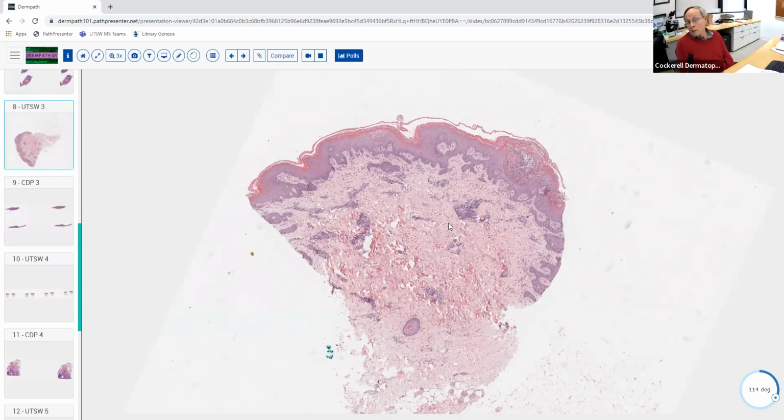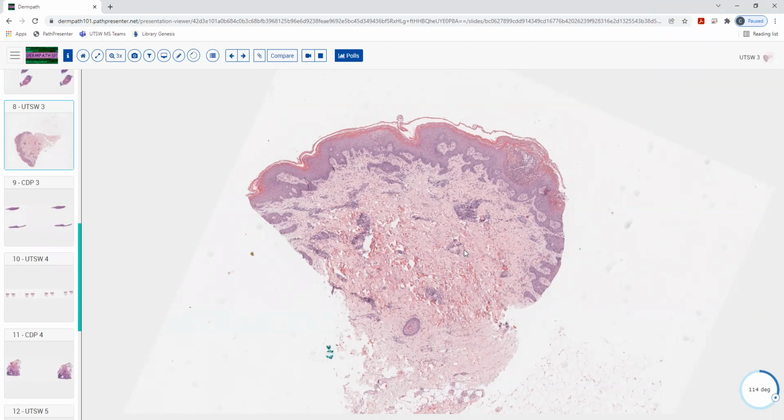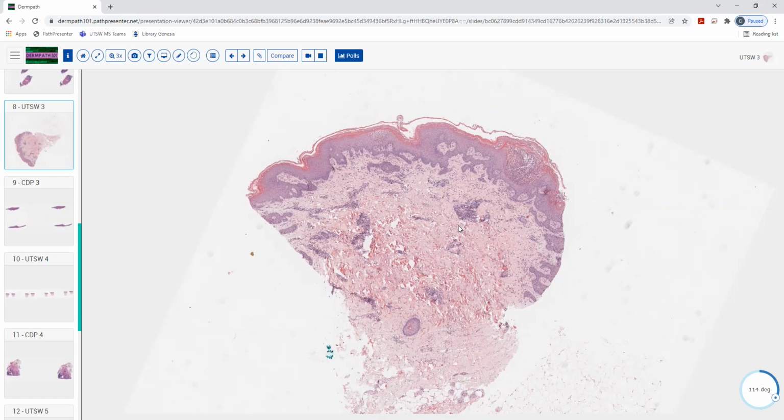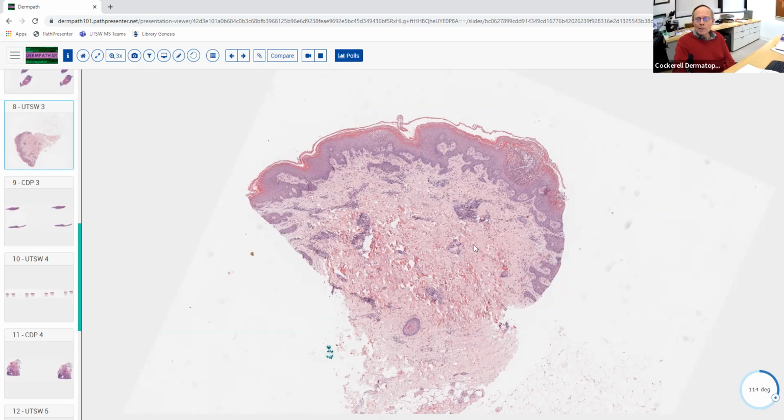Good. We're doing an inflammatory process, right? Mm-hmm. And so you've already said several things. What's the inflammatory pattern in the dermis? In the dermis, it kind of looks like superficial, somewhat perivascular. Yeah, mostly superficial perivascular dermatitis, kind of goes to the mid reticular dermis, maybe a little bit deep, but it's not really nodular or diffuse.